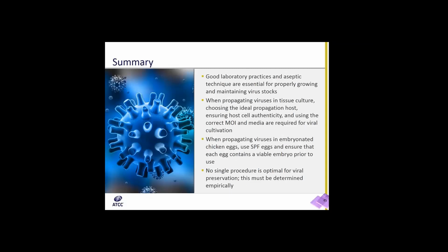So to summarize, we have learned that virus culture is quite complex because of how cell cultures have to be maintained, and also the nature of biomaterials that are used in maintaining these cell cultures and virus cultures complicates the process of growing good viruses. We have seen that it is good laboratory practices and aseptic technique which are essential for properly growing and maintaining virus stocks.